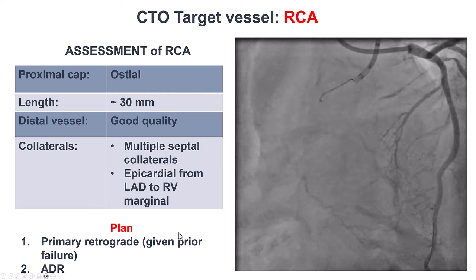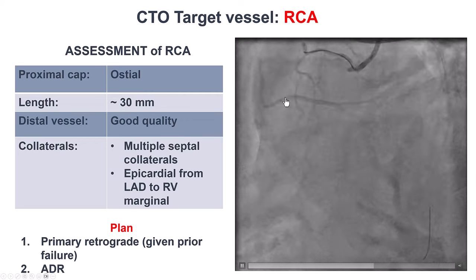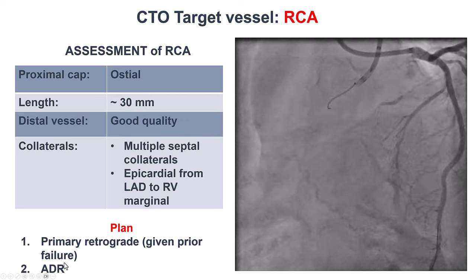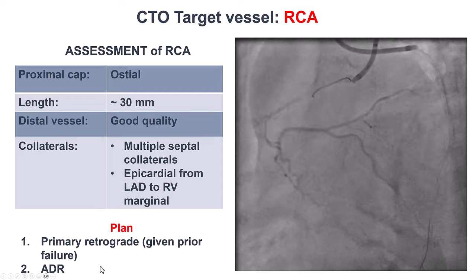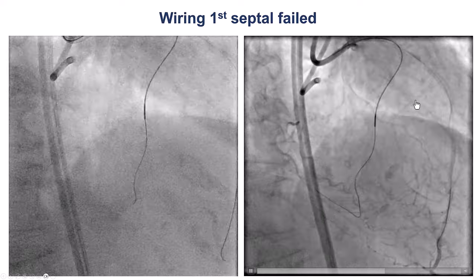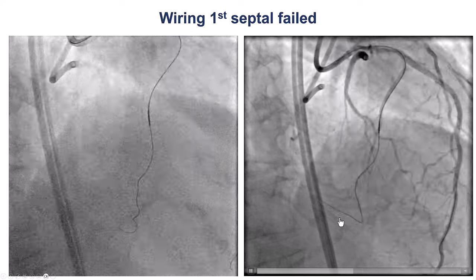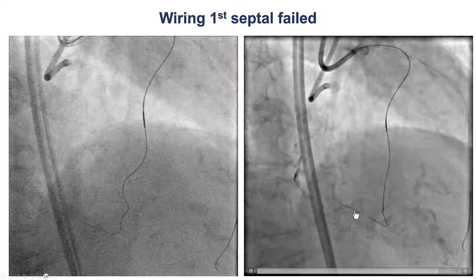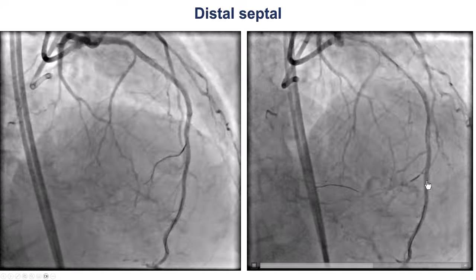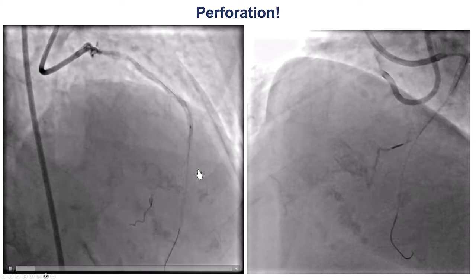There are also some epicardial collaterals. Given the previous failure, our plan was to try with a primary retrograde approach, and if that failed, try it with antegrade dissection re-entry. We tried to wire through the first septal, but unfortunately the wire did not go into the PDA — it remained inside the septum. So we decided to try to cross through a more distal septal and advanced the microcatheter and did surfing.